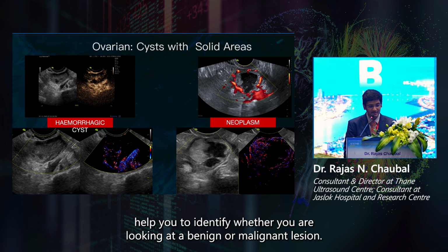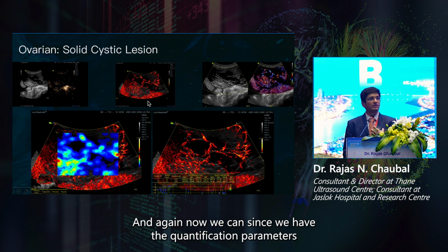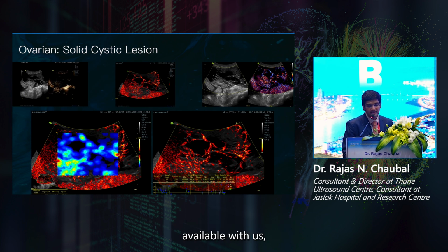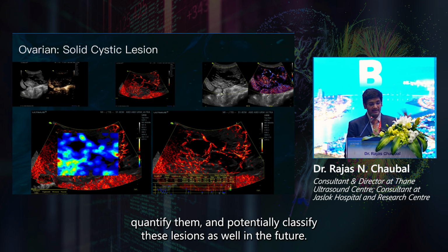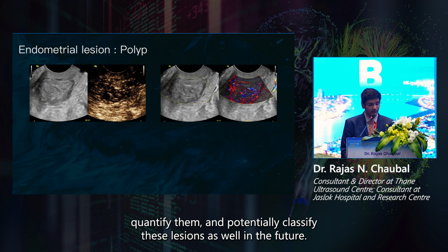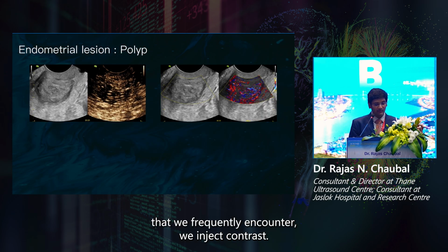a malignant lesion. And again, now since we have the quantification parameters available with us, we can probably look at the enhancement patterns in these solid areas, quantify them, and potentially classify these lesions as well in the future. Now this is one of the challenges that we frequently encounter.